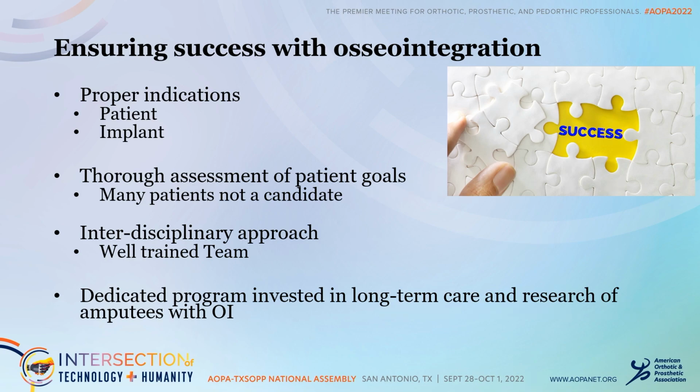So it's really about understanding the goals. I think the patient examples that I gave, someone who's not able to wear a socket at all, with wound breakdown, constant pain, these are the patients that have failed multiple sockets. These are the patients that we want to talk to and counsel and work with you to find that patient population that's right for this technique.